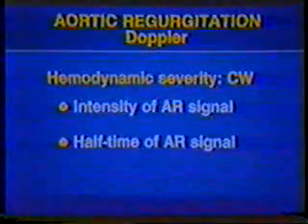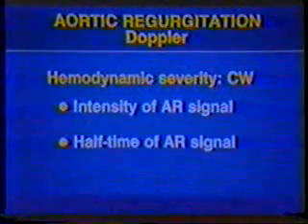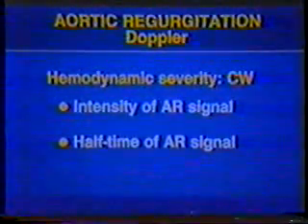As a general rule, the more aortic regurgitation present, the stronger will be the signal. This patient has mild aortic regurgitation. We had to struggle to define the full velocity envelope in diastole. Note that the systolic aortic signals are much stronger than the diastolic regurgitant signals.